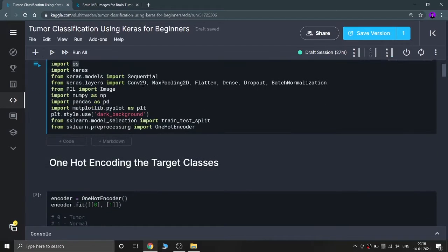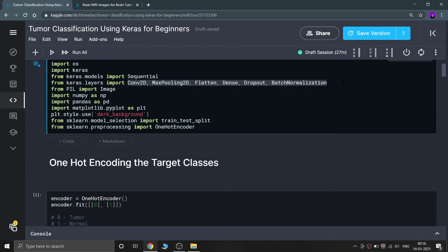Then I am importing Keras, Sequential, and important Keras layers: Conv2D, MaxPooling, Flatten, Dense, Dropout, and BatchNormalization. Then I'm importing Image from PIL, numpy, pandas, and matplotlib, with a dark background for plots. I'm importing train_test_split for splitting data into training and testing, and OneHotEncoder to encode the two classes — yes and no — into integers, so I can feed them into my model.